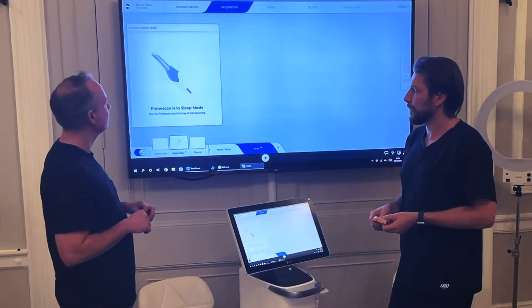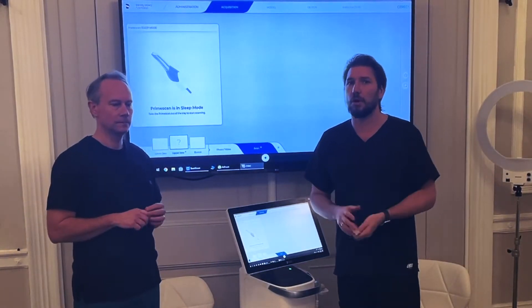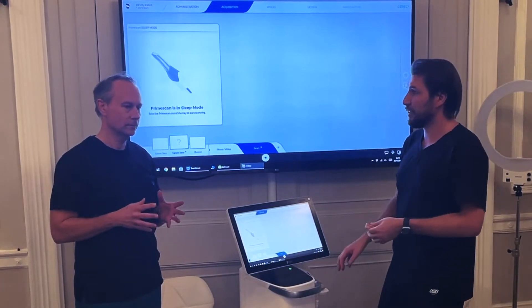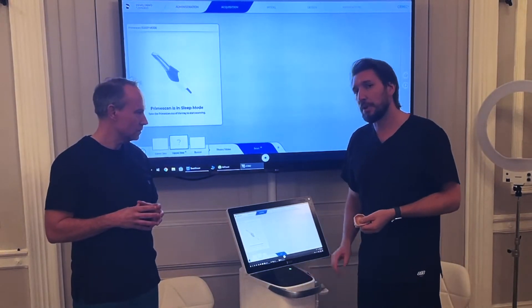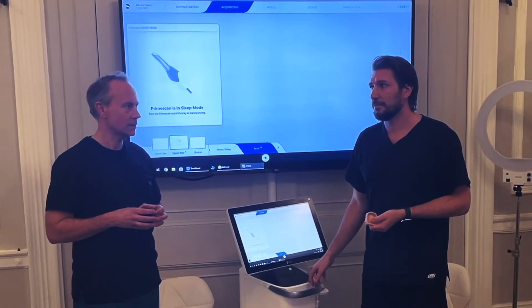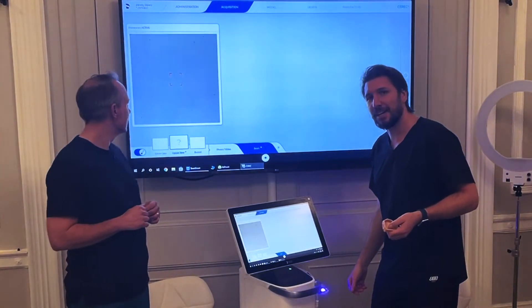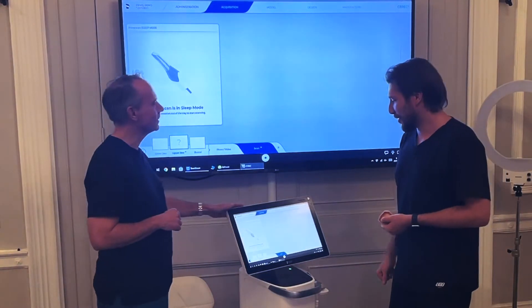Something you might remember if you ever used one of the original Omnicams, Bluecam, or Redcam in the original AC unit — when you had a keyboard you could press space to wake up the scanner. We don't have a space bar; this is how we wake it up. And it wakes it up.